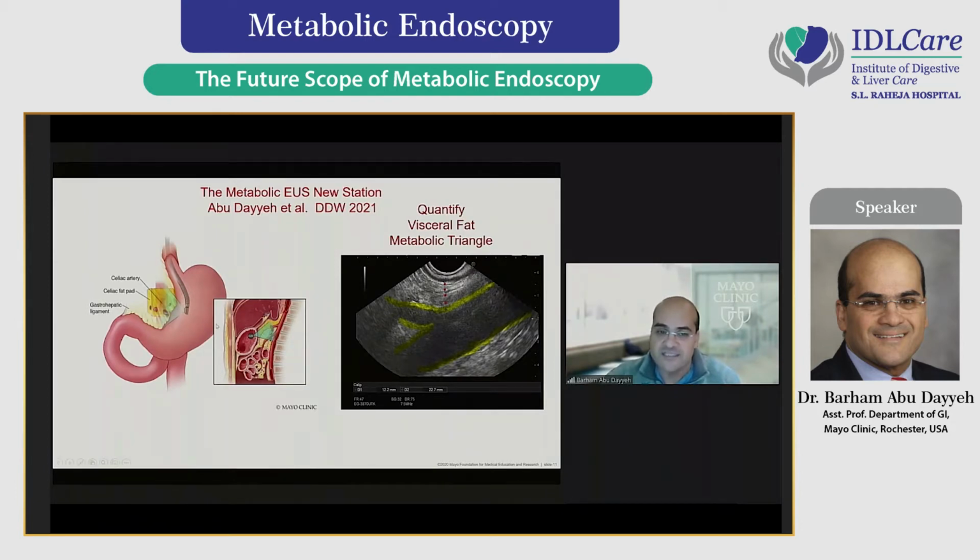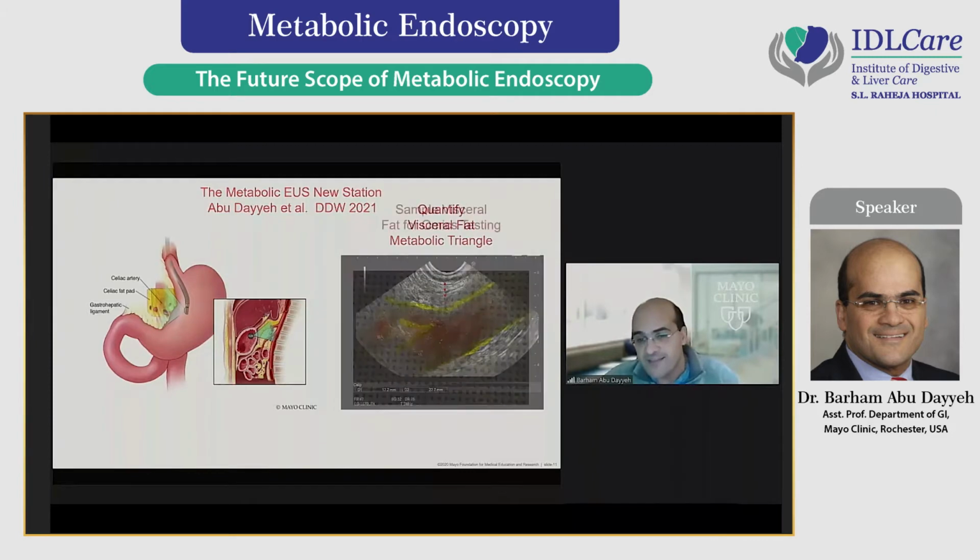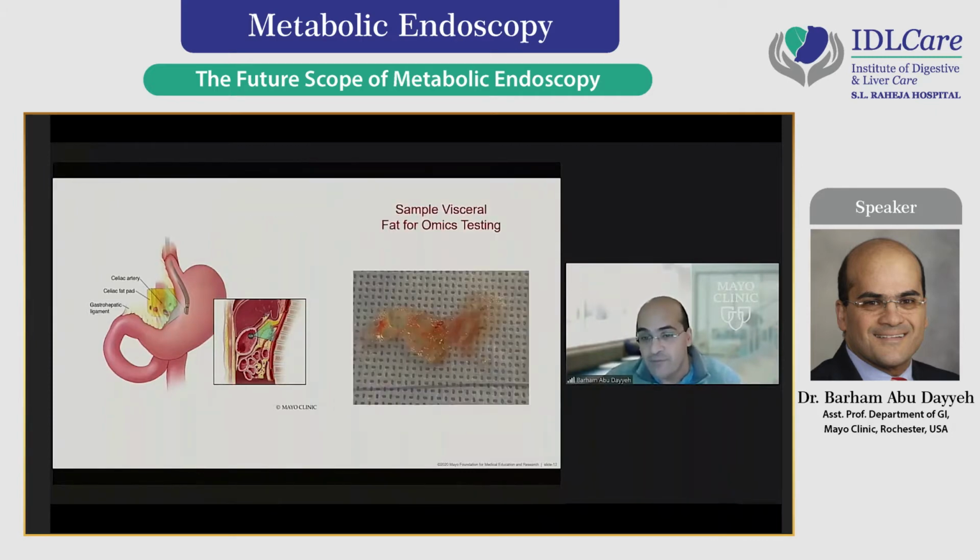And here you could see the access to this area right there as a window to the metabolic health of the patient. Not only we could quantify this triangle, but also we could sample it for multiomics and lipidomics analysis to understand its contribution to human disease, as shown in this slide right here.